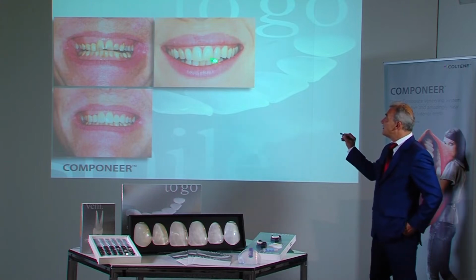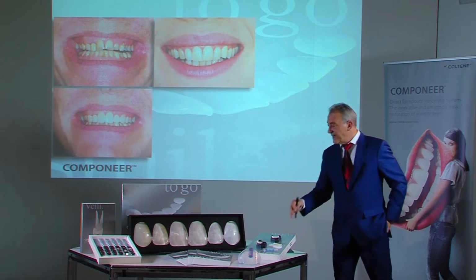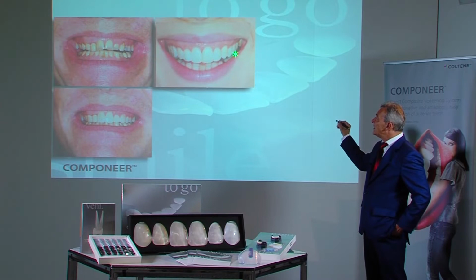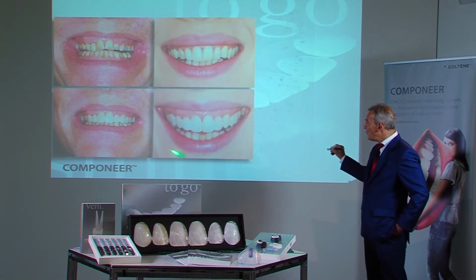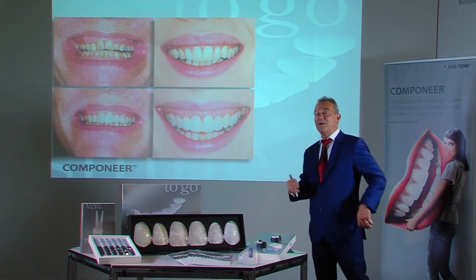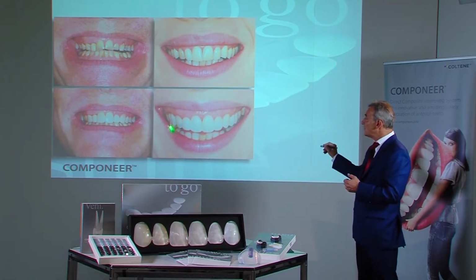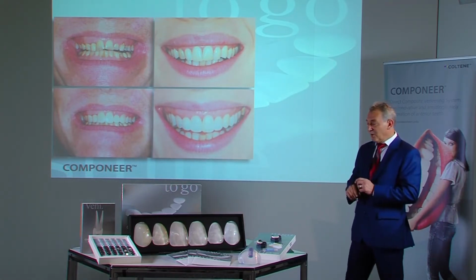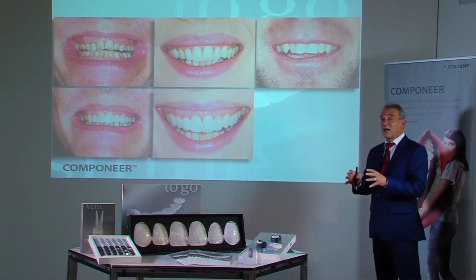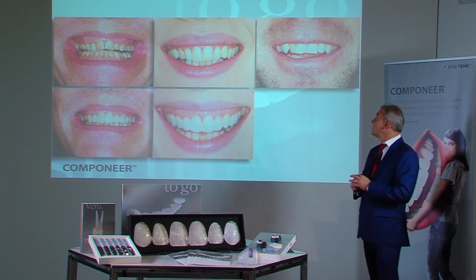Again, slight malposition on the one side and somewhat larger triangles. One imagines the teeth in ideal position in the row of teeth, also in the correct proportions. One conveys this vision to the patient and can show him right away. Therefore, it is recommended to take photographs before and after the application. If you have the facilities, print out the photo. A photo printout can be exceedingly helpful for the patient's decision-making process.